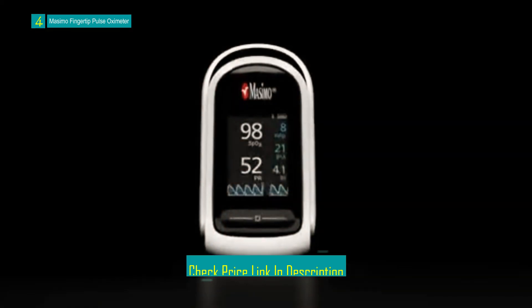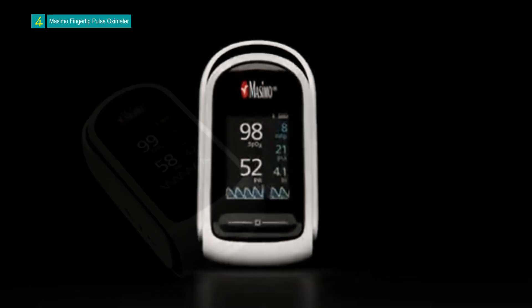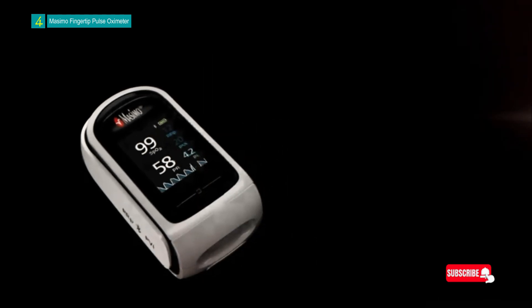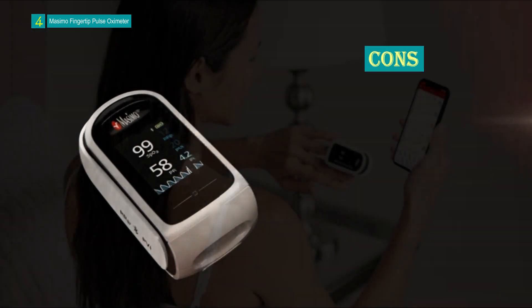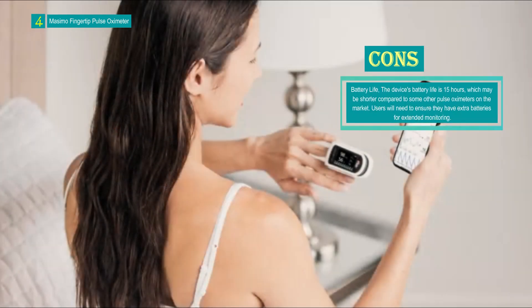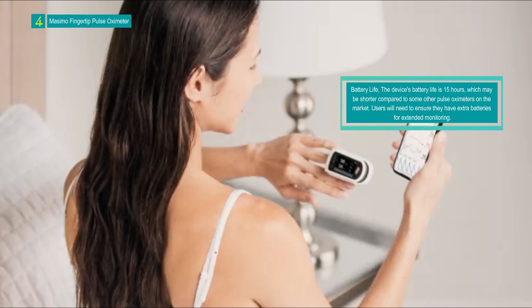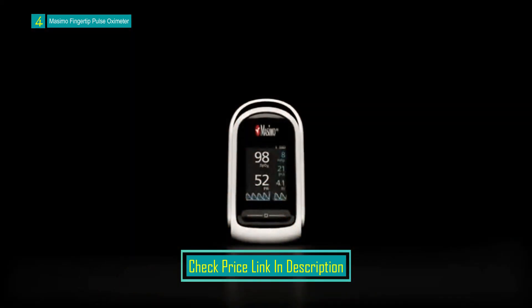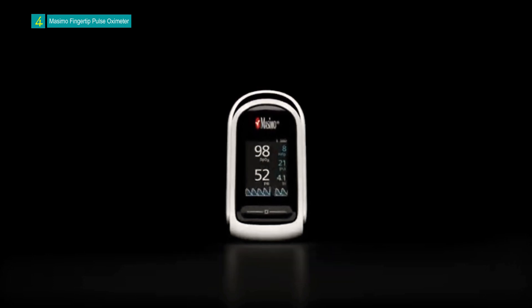The oximeter is designed to provide quick and non-invasive measurements by simply placing a finger into the device's chamber. The package includes two AAA batteries, a lanyard for easy carrying, a soft fabric pouch for protection, and detailed instructions for use. Its compact size, attractive design, accuracy, and comprehensive package — including batteries and carrying accessories — make it a valuable addition to any individual's health monitoring routine.